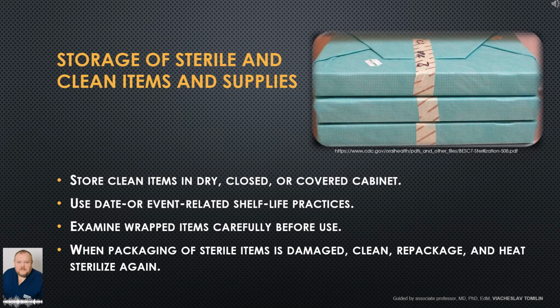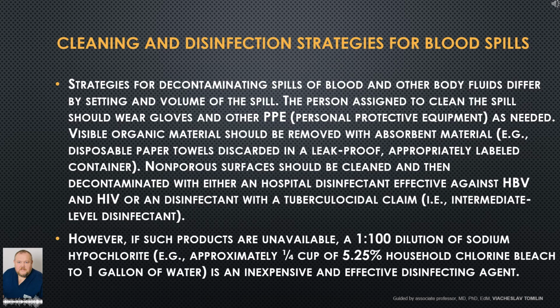Storage of sterile and clean items and supplies. Store clean items in a dry, closed, or covered cabinet. Use date- or event-related shelf life practices. Examine wrapped items carefully before use. When packaging of sterile items is damaged, clean, repackage, and heat sterilize again.